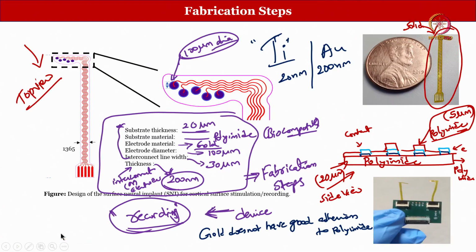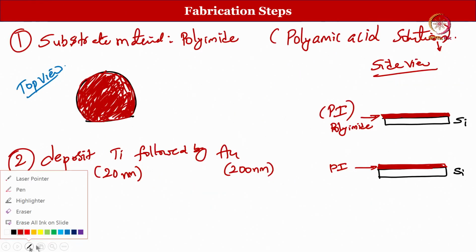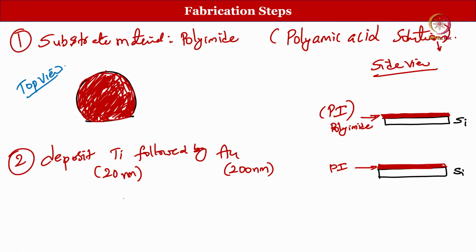What is the color that we used in the last slide? We used some blue or something, it is okay, it is in our hand, we can assume whatever we want. So, let us say there is a thin layer of titanium, and these are not drawn to scale, do not get confused, okay. I am just giving a disclaimer now. Now, this is Au, gold.